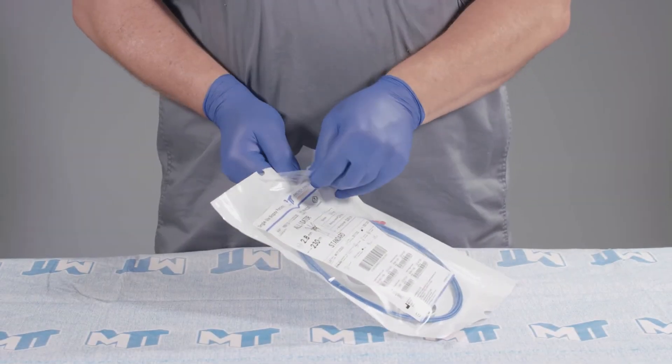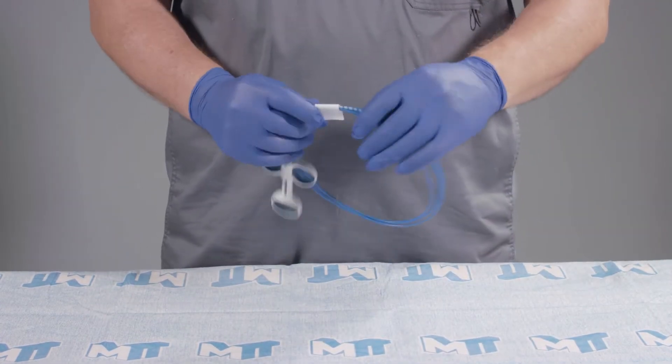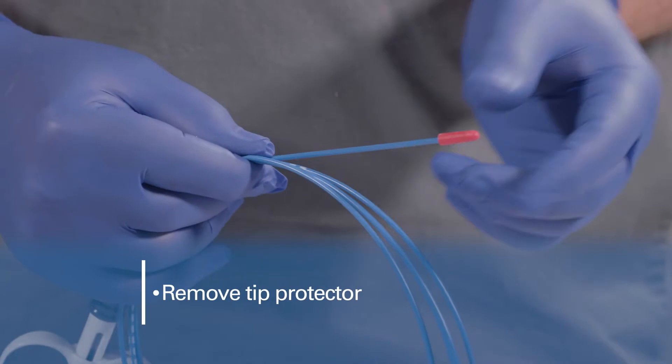Open the pouch and carefully remove the biopsy forceps from their packaging and uncoil. Then remove the tip protector.